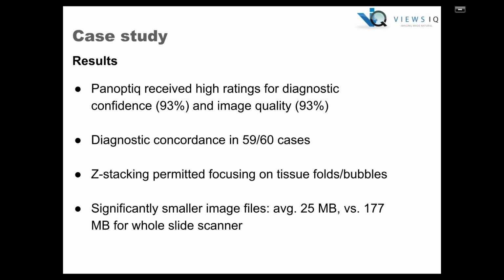So just reviewing the results, Panoptic received high ratings for diagnostic confidence and image quality. There was diagnostic concordance in all but one of the cases, so 59 out of 60. And the authors also found that the Z-stacking function allowed accurate focusing on tissue folds and bubbles, which were not always captured accurately using the whole slide scanner.